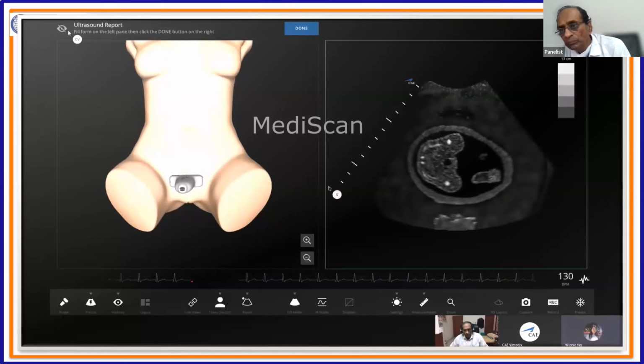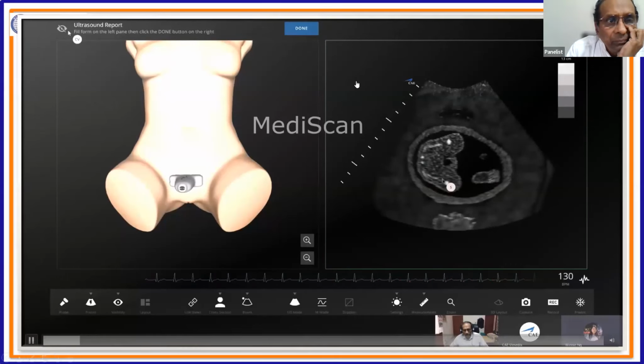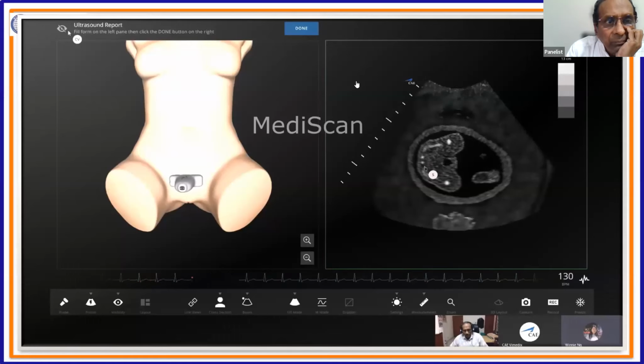And as I observe the presenting part, I can see the bladder. Obviously, it's a breech presentation, and the spine is to the mother's spine. So in other words, I'm seeing a cross section of the spine. That means this baby is lying longitudinally in the abdomen with a breech presentation and the spine to the mother's spine. So let's move on to step number 2.